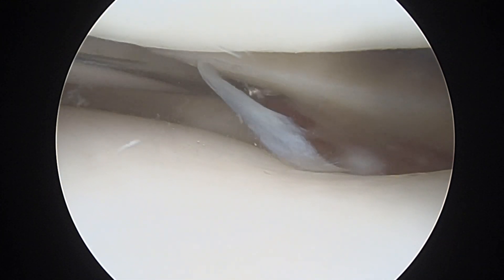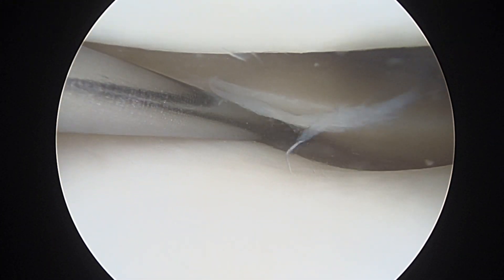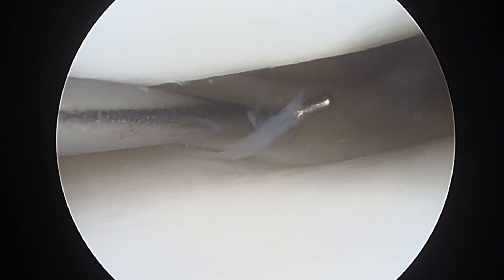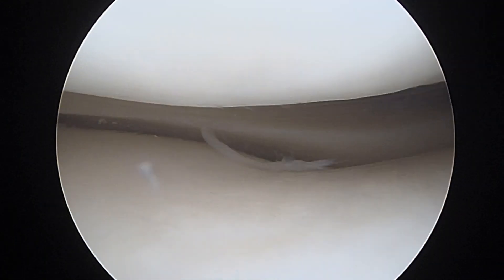A little inner rim tearing. Overall, that looks really very good. We don't need to do anything with that at all. It's absolutely fine. Let's go bend up all the way, Jeffrey. Flexion.